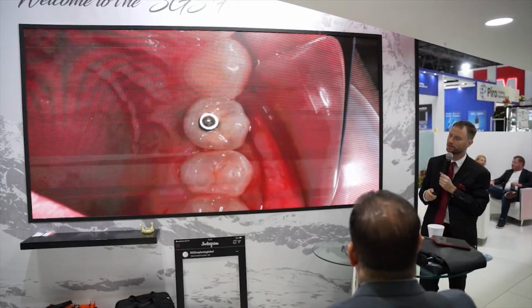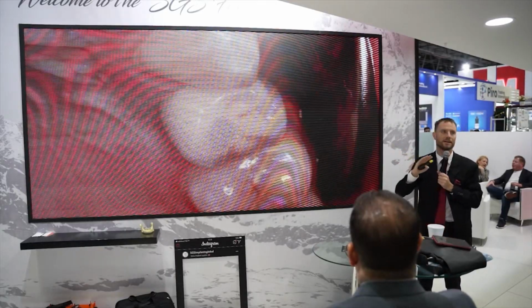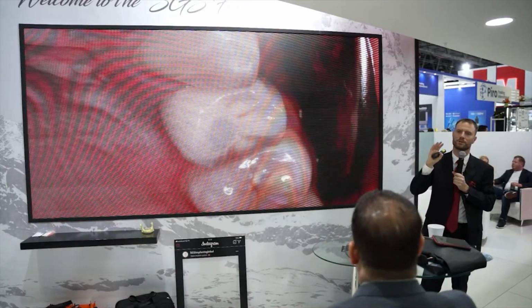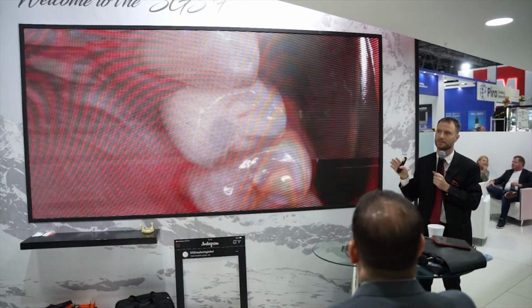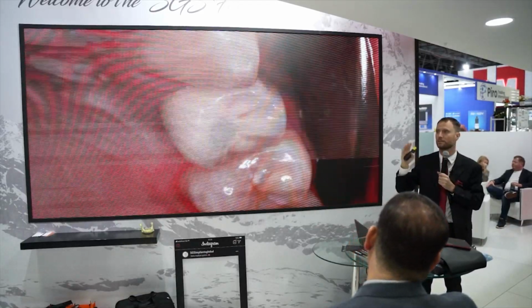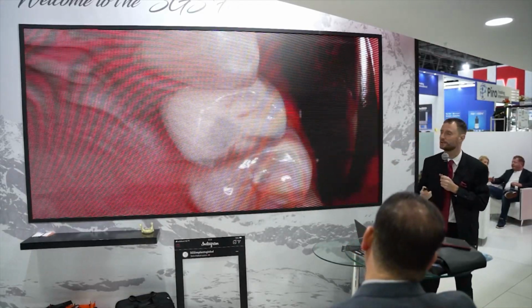Soft tissue formation, and then a screw retain crown. Simple thing, I don't like to overcomplicate the things. For single tooth, a nice, easy screw retain crown is the best. Anytime you can remove, if patient loses other tooth, you can transform it to be a bridge. So you have several options how you can do that.